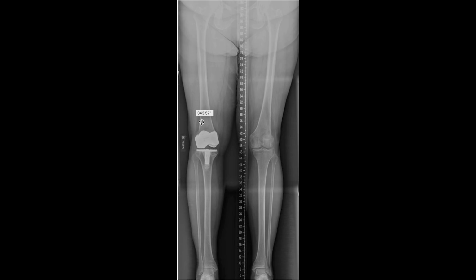This would be a varus position of the femoral component, and this would be a valgus position of the femoral component. This would be a varus position of the tibial component, and this would be a valgus position of the tibial component.